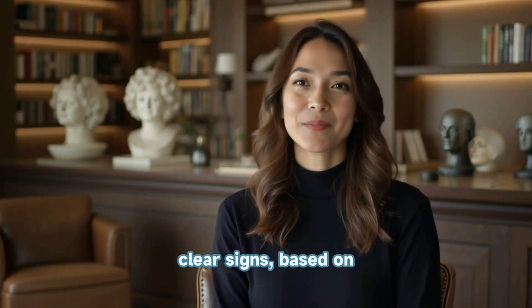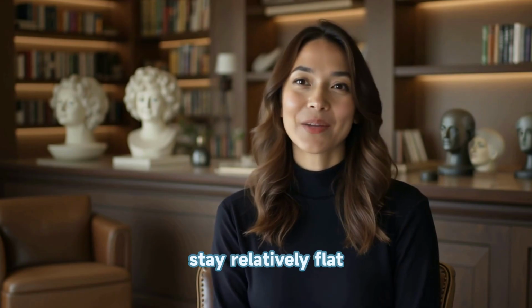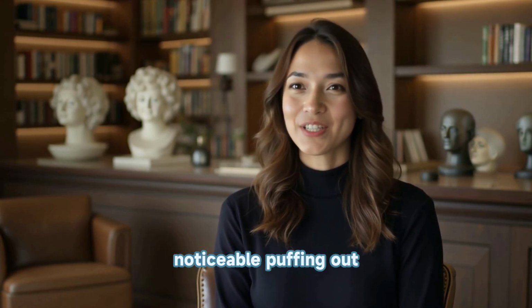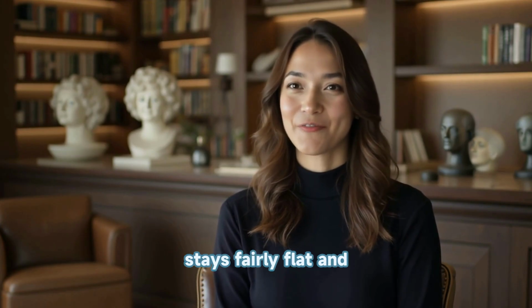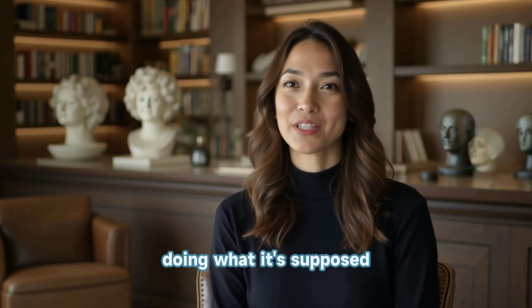The clear signs, based on the sources, are pretty simple observations. Firstly, does the bag stay relatively flat most of the time? You're not getting significant, noticeable puffing out or ballooning. Okay, no ballooning. And secondly, are you noticing any odors coming from the bag itself? If the bag stays fairly flat and odor isn't an issue, the filter is likely doing what it's supposed to.